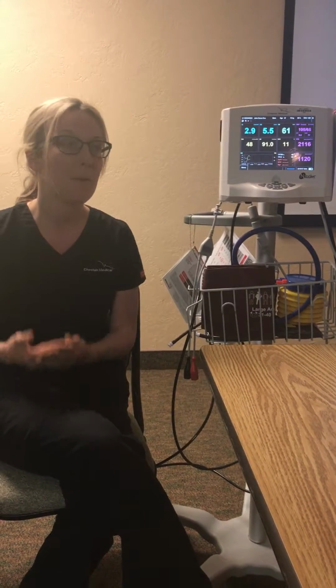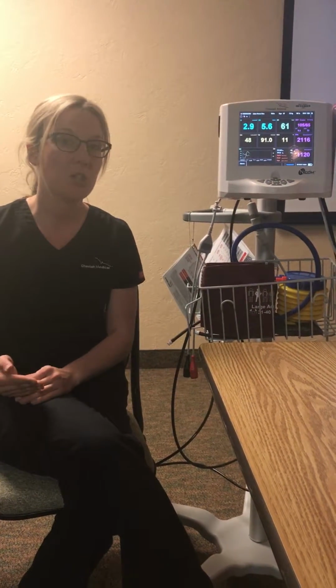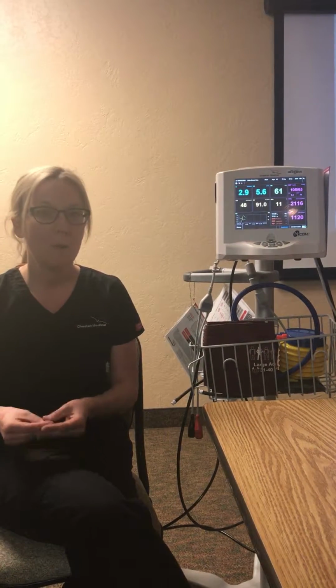So the goal for any patient, whether it's you, me, the people who come to ICU, is perfusion, because we want to make sure we're getting adequate nutrients to the organs and thus sustaining life. Now, most commonly we measure perfusion by blood pressure, cap refill, making sure our patients are warm and dry, urine output, lactate, but those are all late signs of perfusion. What we need to focus on more is hemodynamics.